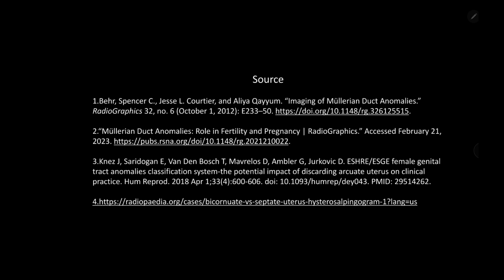So in this video, we talked about Mullerian duct anomalies, its imaging features, why is it important for us to learn about Mullerian duct anomalies. We learned briefly about the embryology, the classification systems which are available for Mullerian duct anomalies, their advantages, their disadvantages. We also learned about the difference between certain anomalies and also how to use the American Society of Reproductive Medicine Mullerian Anomalies Classification 2021 webpage tool. Hope this video helped to understand Mullerian duct anomalies better. Thank you.